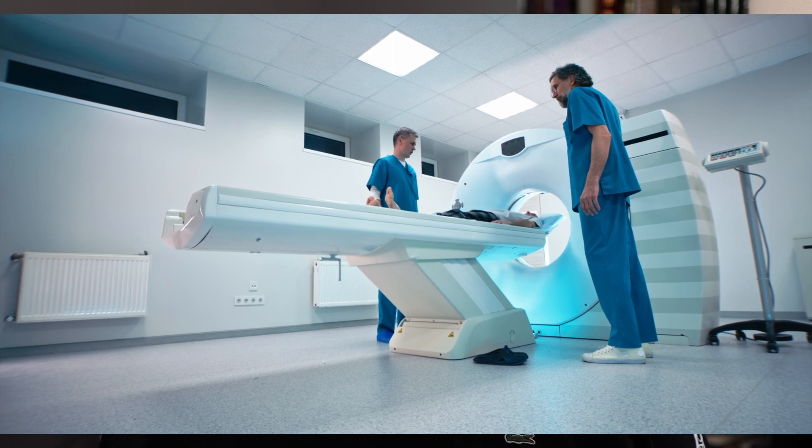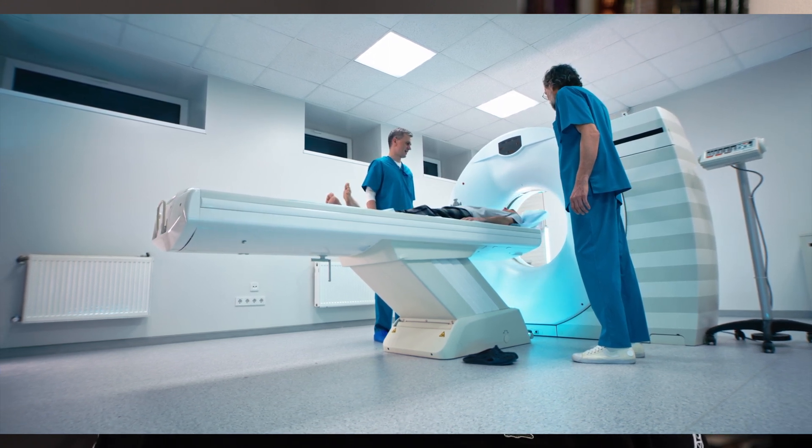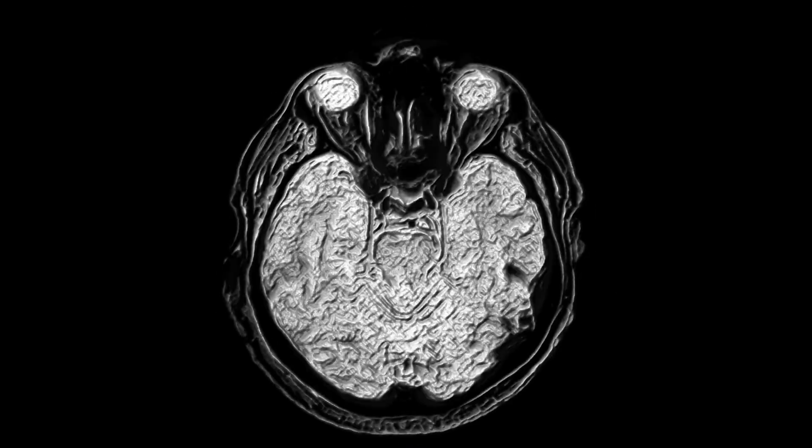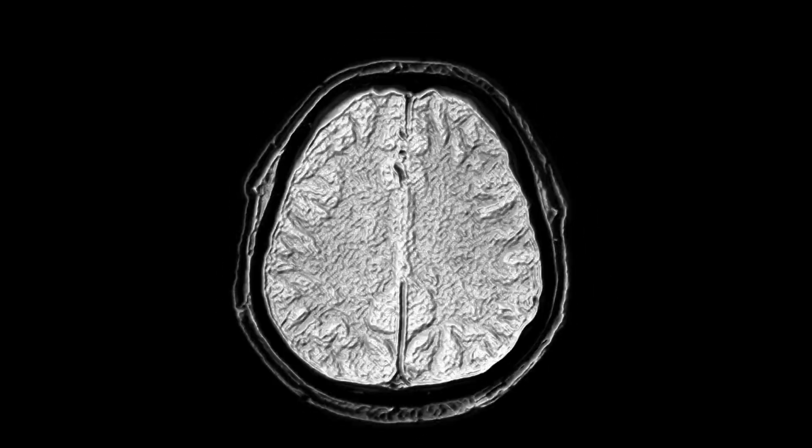The next step is a CT — computerized tomography. A CT uses radiation and is done relatively quickly, anywhere from one minute to about ten minutes if using contrast. Instead of one picture, it takes a series of many images and puts them together to create a 3D model, so you can see more tissue differences, blood vessels, and blood clots.